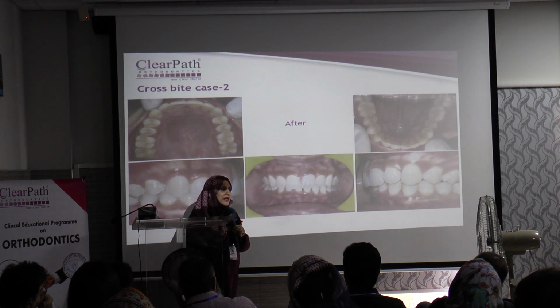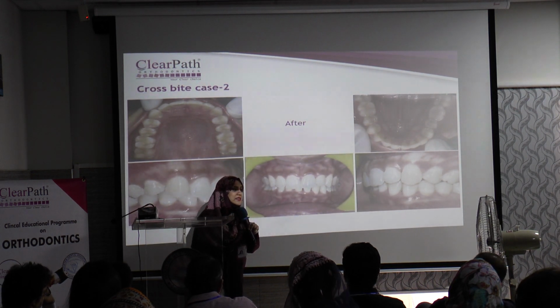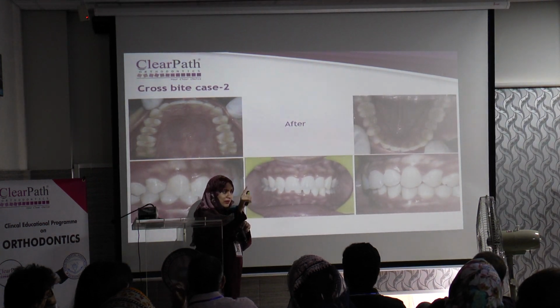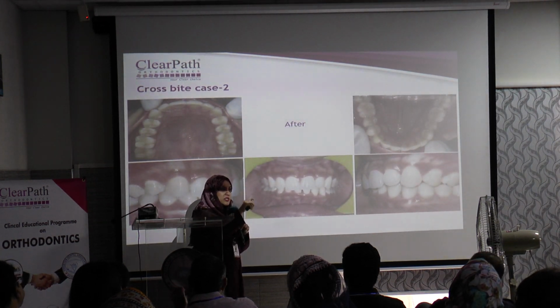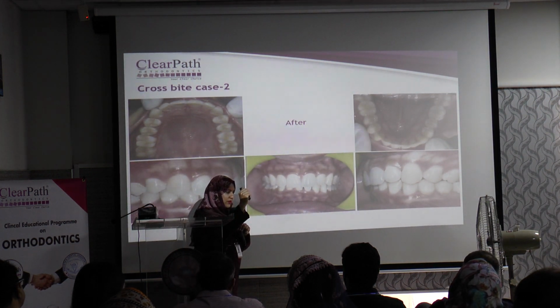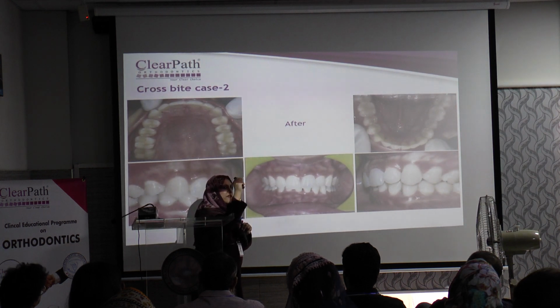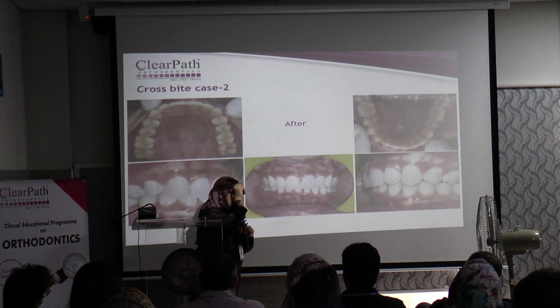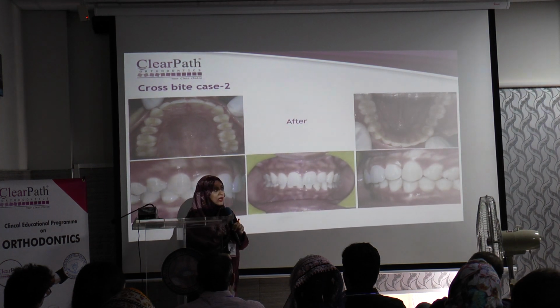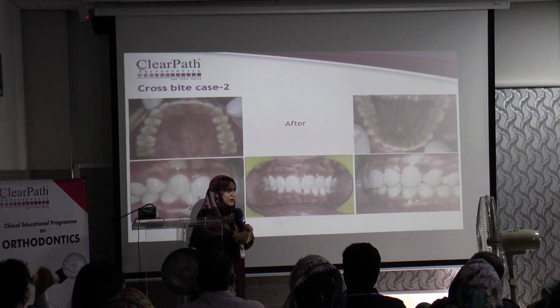Actually for that, in the aligners we insert cuts and slits. We make a cut for the button, where some surface is visible, so on that part you can insert the button. And in the upper arch we give a hook-like structure in the aligners that's known as a slit, from where you insert the elastic button. I have the picture in the upcoming slide that will make it clearer.